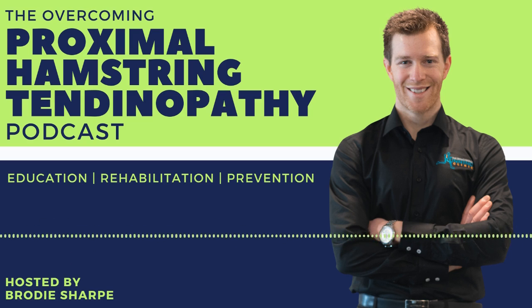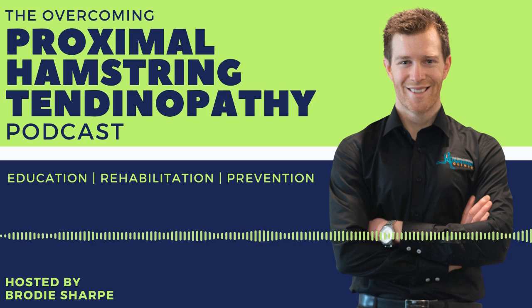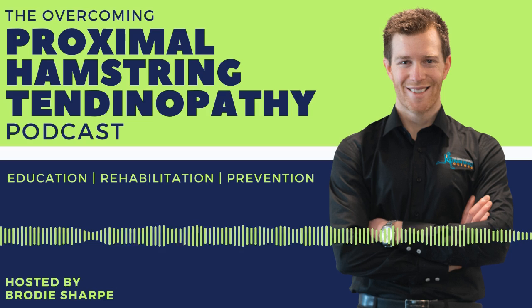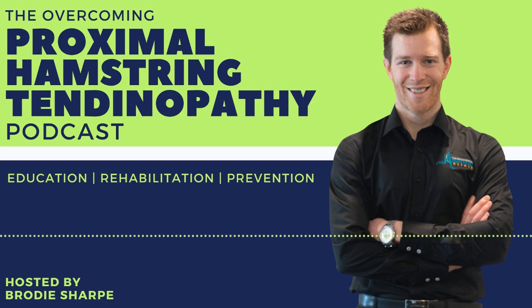From a very simplistic point of view, when I explain this to a patient, I don't really use the word Shockwave. I say it's high energy sound waves. It's basically sound. It doesn't have any magnetism or medications or anything else. Compared to ultrasound, the peak pressure of Shockwave is at least 1,000 times more powerful. You could use ultrasound on somebody for 15 hours, but what you can do in 15 hours, you can deliver in about 1 minute, much quicker. It's very powerful high energy, and it's naturally found in nature, like thunder. In physics it's called sonic booms. It's powerful enough to break glass.